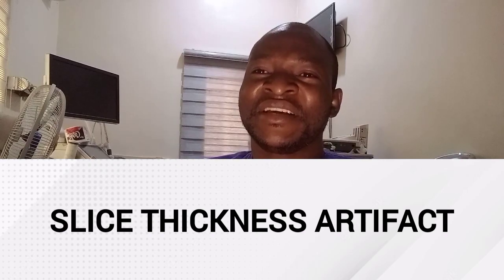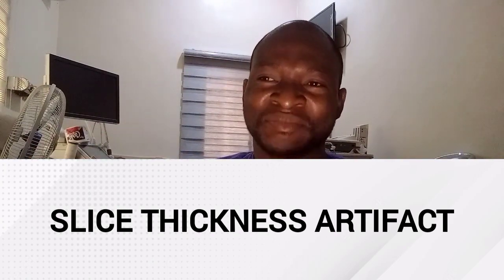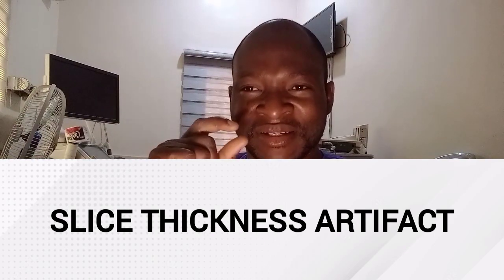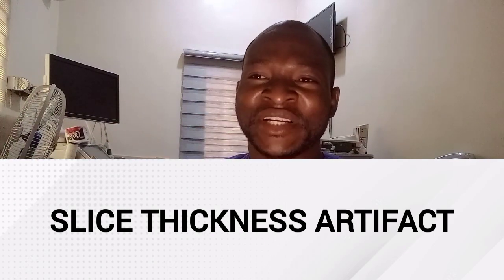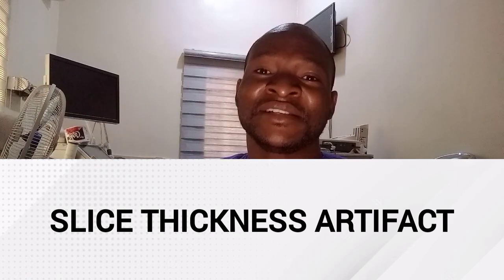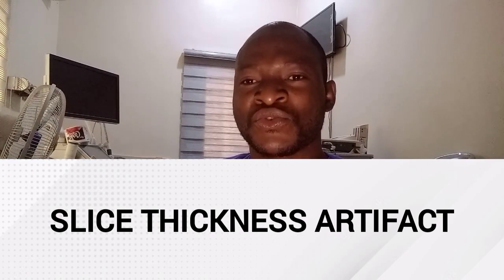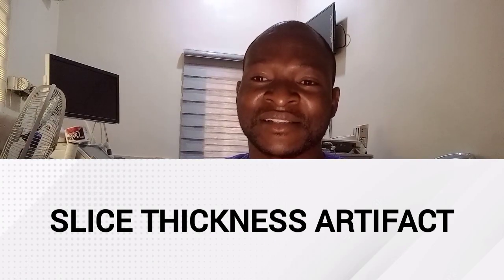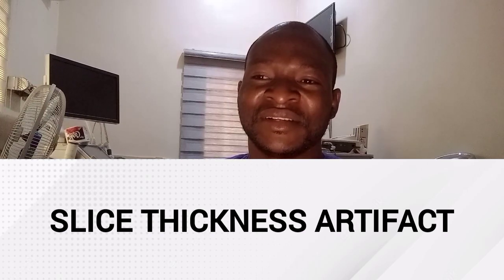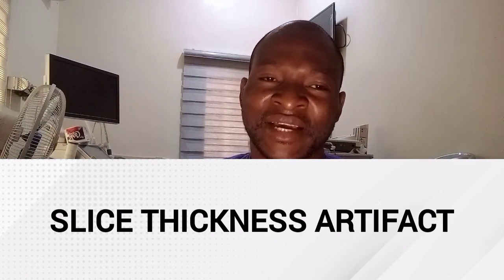We assume the ultrasound beam is razor thin. That's the assumption, but in fact, it has a measurable thickness. So any echo generated from the beam edge will be displaced as though it has arisen from the center. This is most apparent when most of the beam travels through fluid, but part of the beam interacts with the adjacent soft tissue. Echoes from this interface will be displayed as having arisen from inside the lumen.